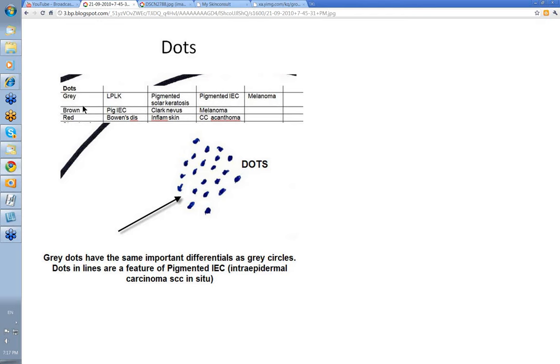When you get brown dots it tends to indicate melanin at the level of the dermoepidermal junction. Whereas grey-blue dots tend to be melanin that's deeper in the dermis, perhaps in melanophages, or if they're bluish, sometimes just free melanin in the dermis. Red dots — a lot of people don't count these — but they're usually vessels that look like dots, sometimes actually just coiled vessels.